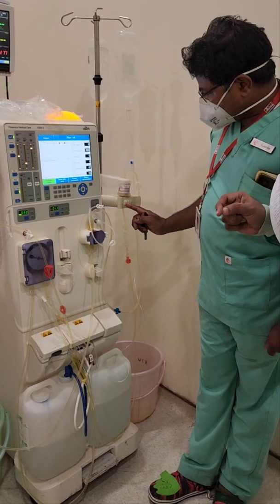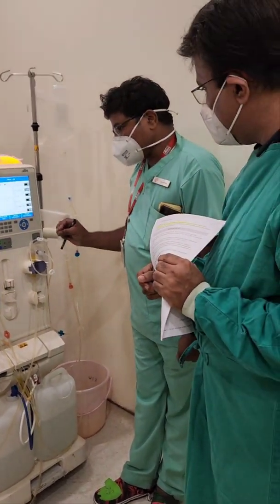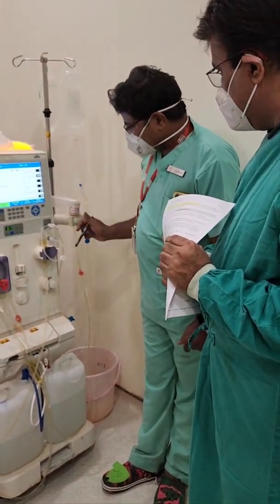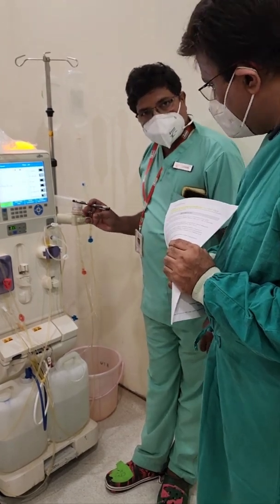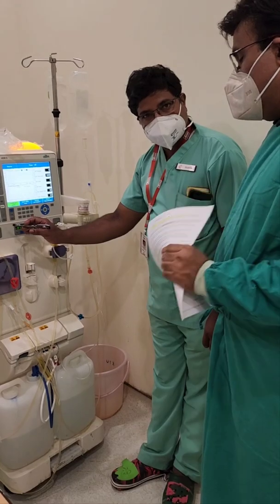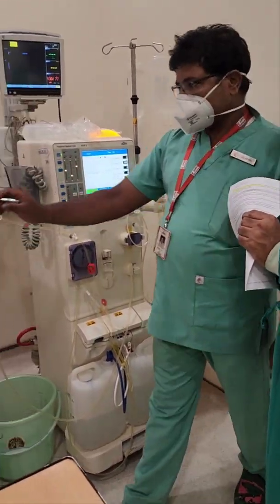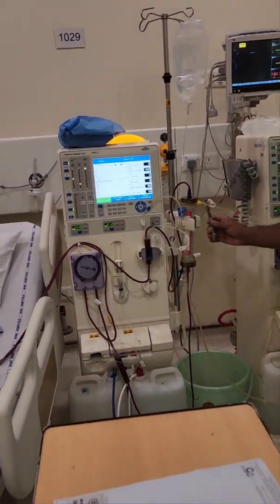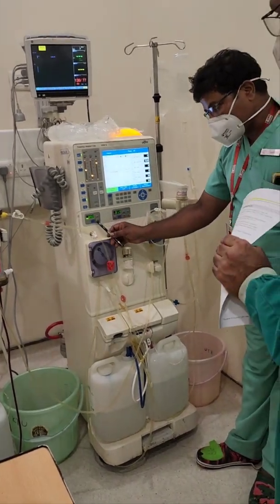What does the column do? Basically, it removes the anti-ABO antibodies. Priming is the most important part of this setup. Here, the blood flow on the column side is just 50 ml per minute — this is very important. In contrast, you can see the first machine is running at 200 ml per minute, while the second machine, connected to the column, runs at 50 ml per minute.